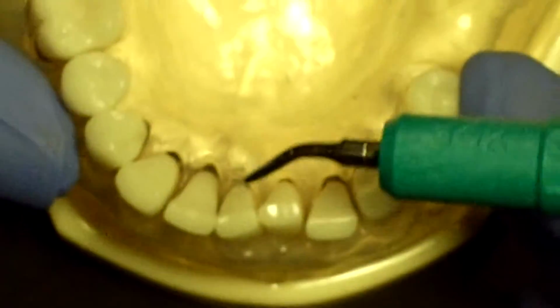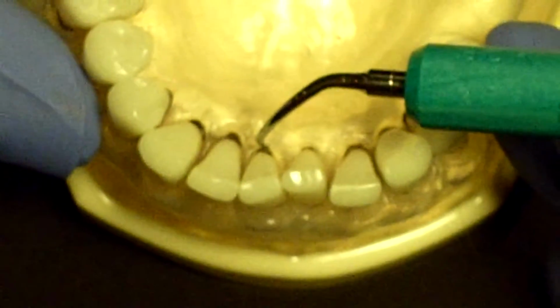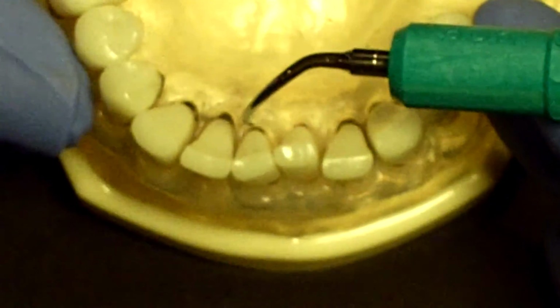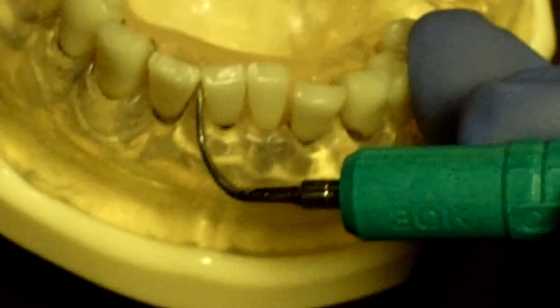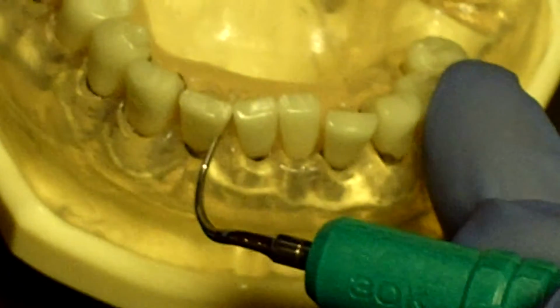Same thing here on the anterior, you could use it on the anterior as well. Vertical for periodontal, and then we know on the opposite, we can use it just like a sickle, as long as we have the correct adaptation.